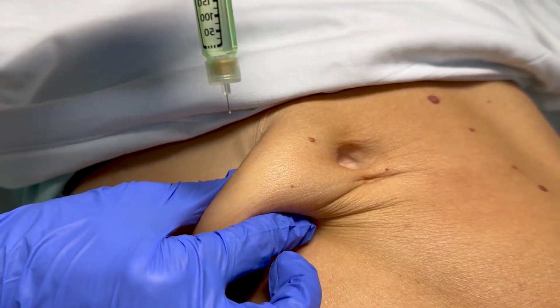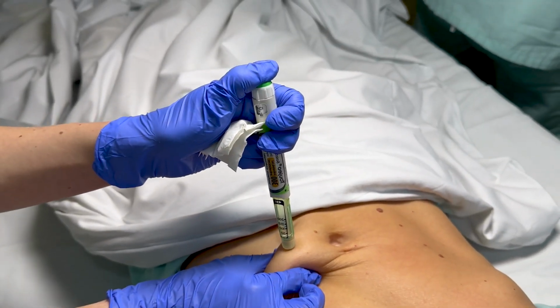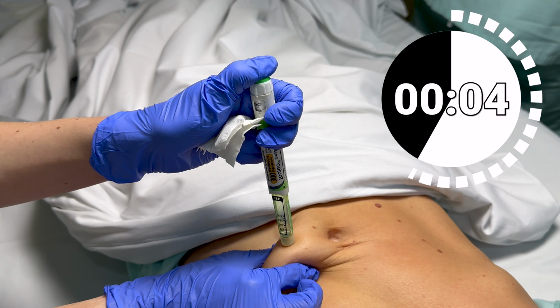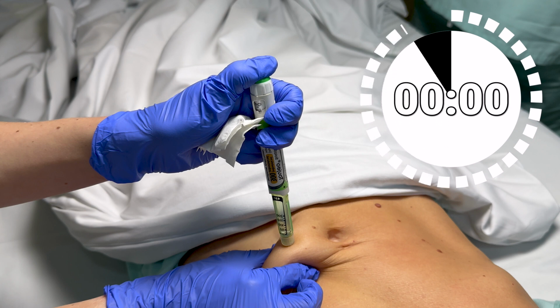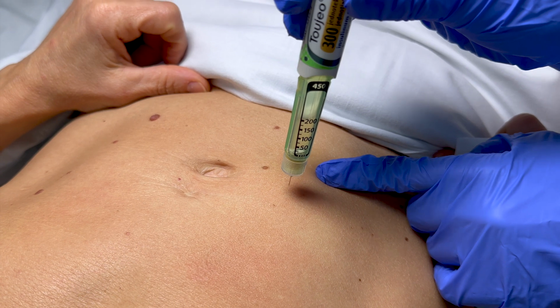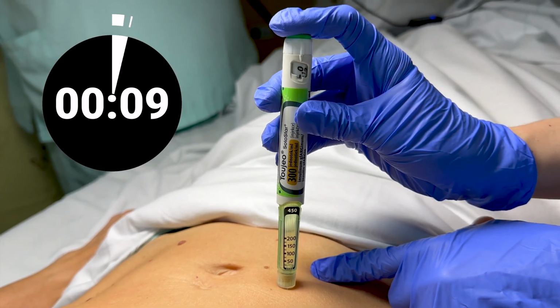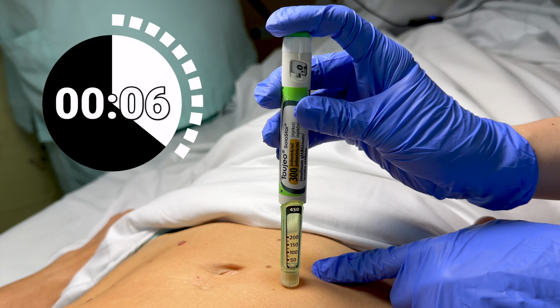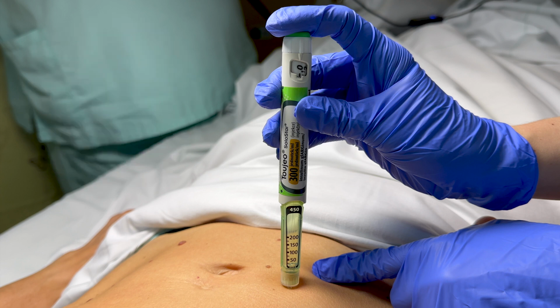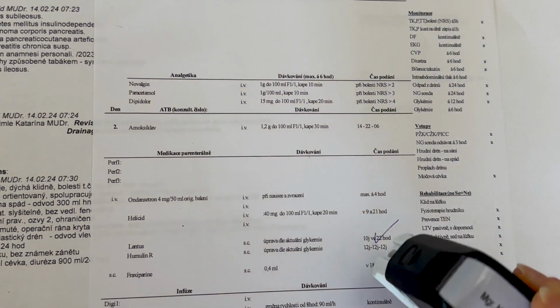Disinfect the injection site. Inject the needle into the subcutaneous tissue, either with or without a skin fold at a 90-degree angle. Do not aspirate. Press the plunger on the insulin pen. Wait for 5 to 10 seconds to prevent insulin leakage from the skin. Apply a gauze pad to the injection site. Withdraw the needle from the skin and do not massage the injection site. A record of the medication administration will be made in the documentation with full identification.